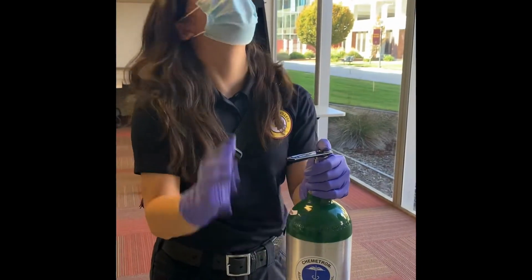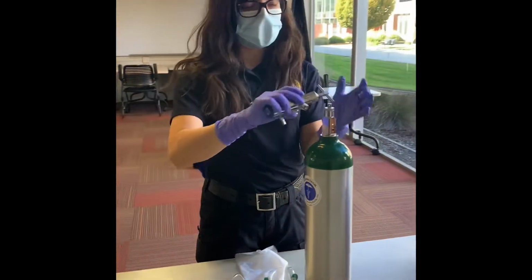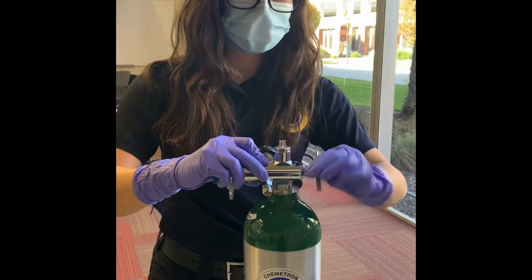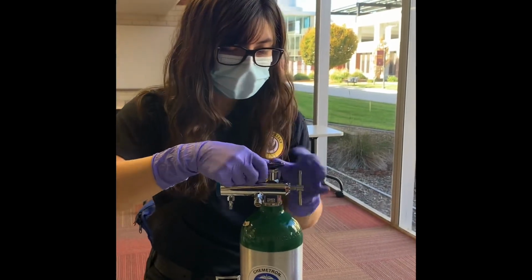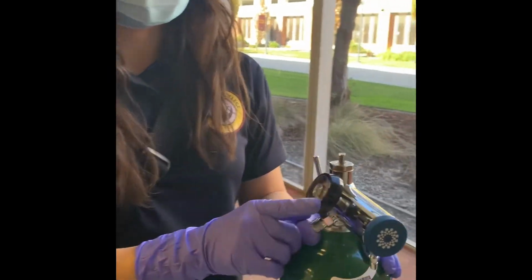So I'm gonna get my oxygen tank ready by cracking the valve. Okay, so proper airflow in the tank. I'm gonna apply my regulator. I'm gonna go ahead and open my oxygen tank. And as I'm doing this, I'm listening for leaks, so checking for leaks and also checking to see that there is a good amount of oxygen there.